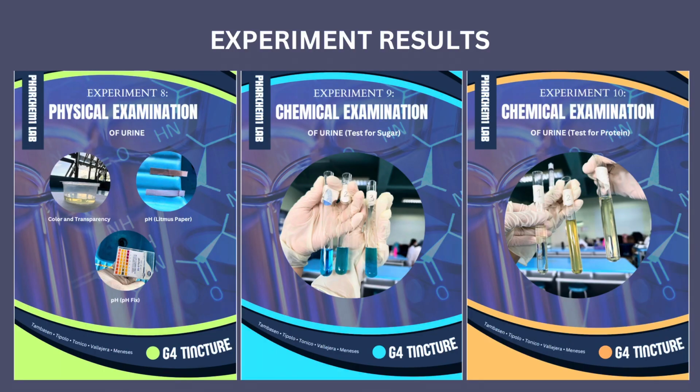Experiment results. Physical examination of urine, chemical examination of urine, test for sugar, and chemical examination of urine, test for protein.